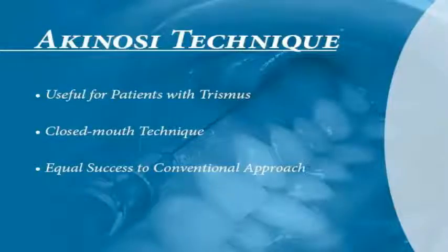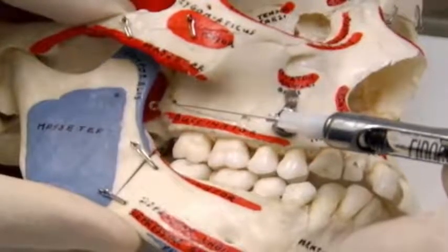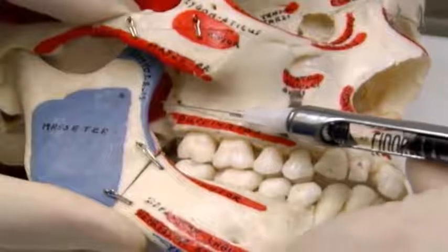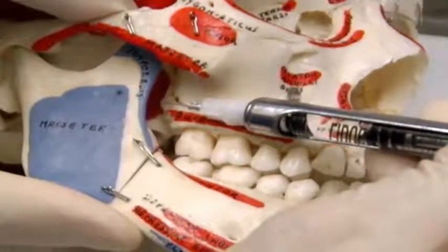The Akinosi technique. This technique is an effective and useful anesthetic means for a patient with trismus. In other words, it is good for patients who cannot open their mouth wide enough for the conventional approach. As seen on the skull, the syringe handle is parallel to the occlusal plane and is about the level of the mucogingival junction. The needle is directed straight posteriorly to about three-quarters of the length of the needle.